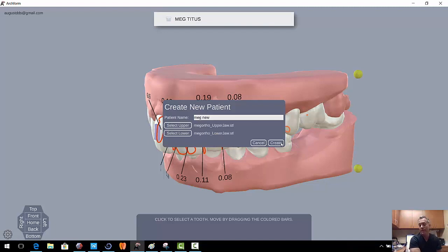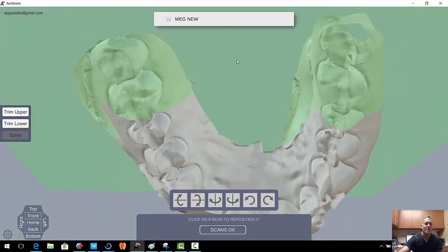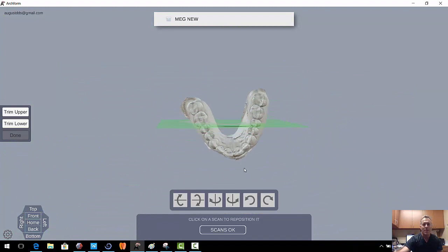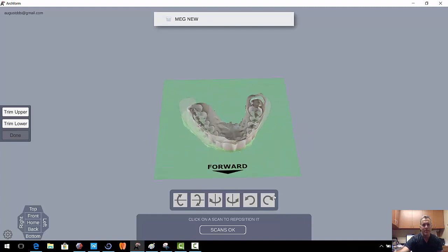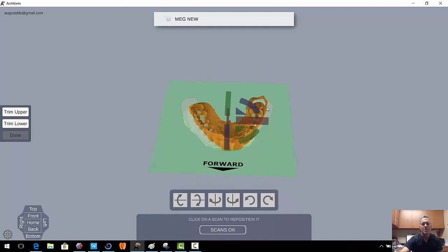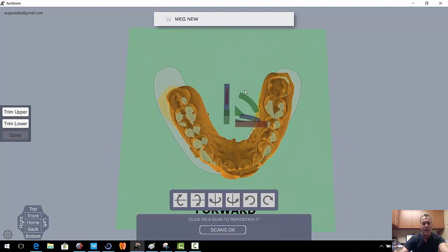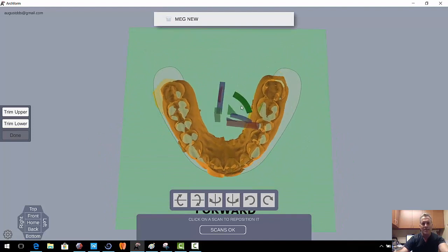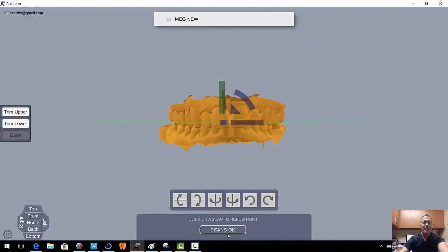One of the first steps we're going to be playing with is orienting our models. I don't know why, but when it's taken out of a CRX scan, the models are in occlusion. However, they're sitting kind of straight up and down. So we can click on these little tools and orient them so things are looking a little bit better. There is a little arch form on here if you want to move your model around within the arch. You got to make sure, though, you select both of them at the same time if you're going to rotate. In order to do that, you hit the Shift key, and you can now select both, and now we can move them and rotate them and put them on this plane a little bit better. So we're going to go ahead and hit OK.